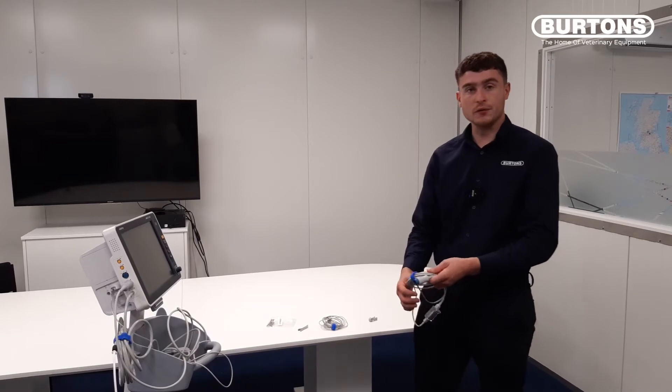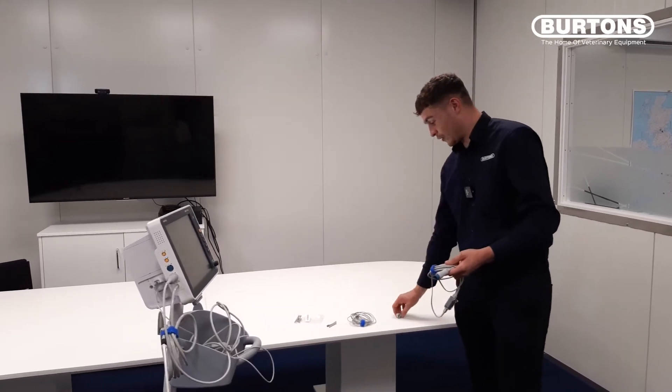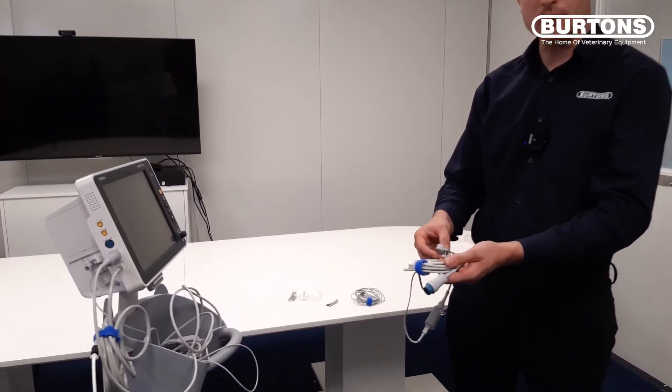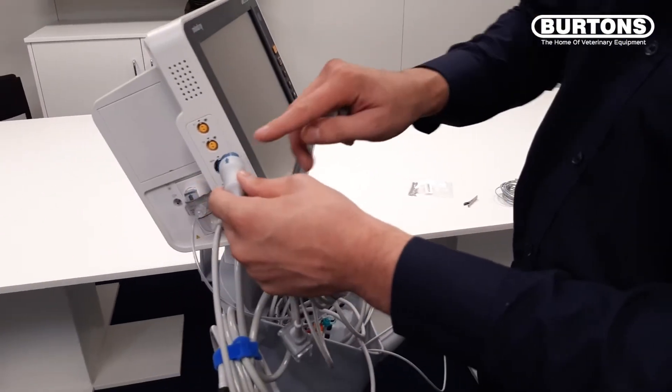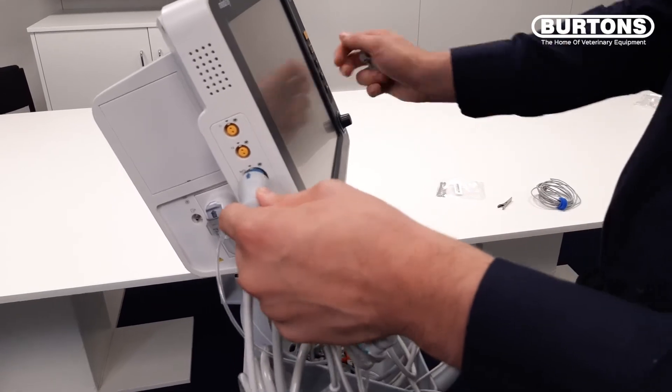This is the SPO2 cable and it comes with two different sizes of lingual sensor holders. To attach, we just line up the arrow and insert the blue end into the blue port.